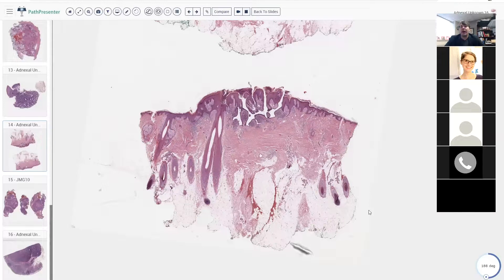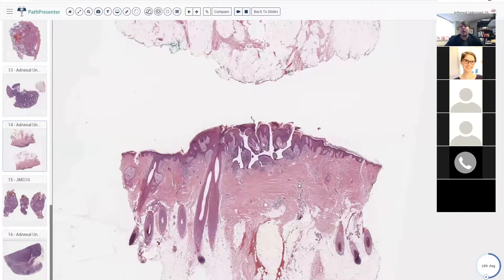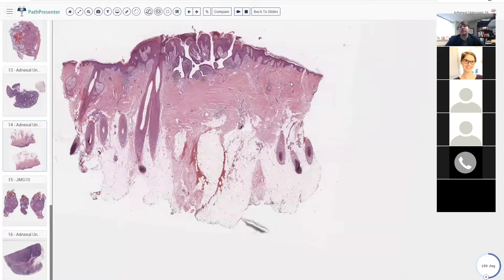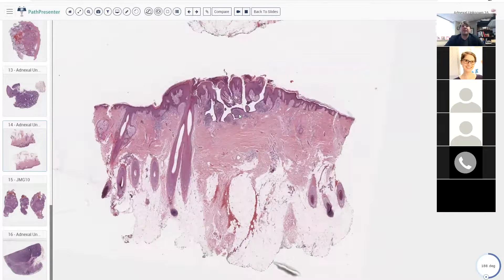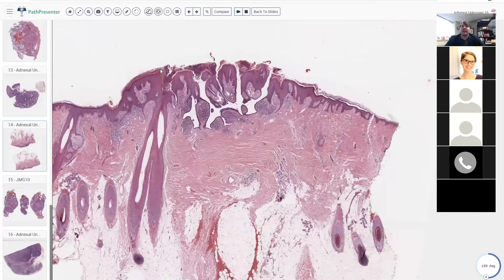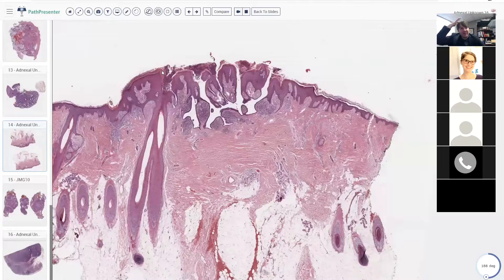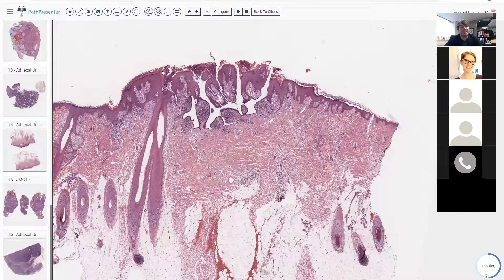Someone very nicely pointed out that it looks like an organoid nevus, or a nevus sebaceous depending on what name you like — and basically yes, it's a hamartomatous process. Here we've got acanthosis of the epidermis, and we also importantly have normal hairs, then the normal hair is gone, and then the normal hair has come back. So in organoid nevus, epithelial nevus, nevus sebaceous — all of these overlapping entities — you often have a thickening or acanthosis of the epidermis, often with a wart or seborrheic keratosis-like pattern, and then you have loss of the underlying hairs, a kind of patch of alopecia along with the lesion.